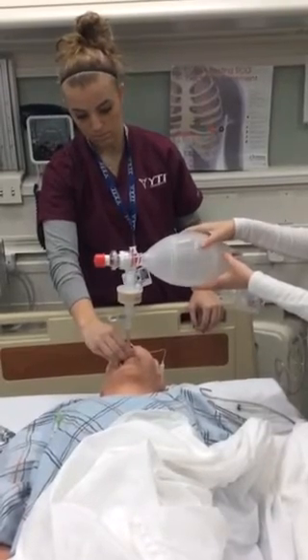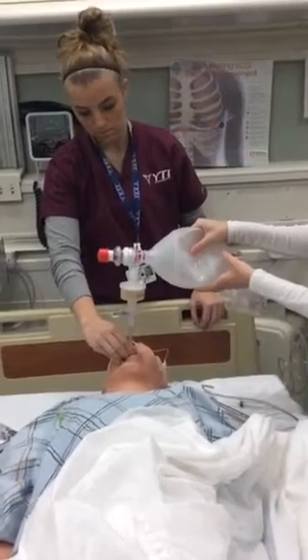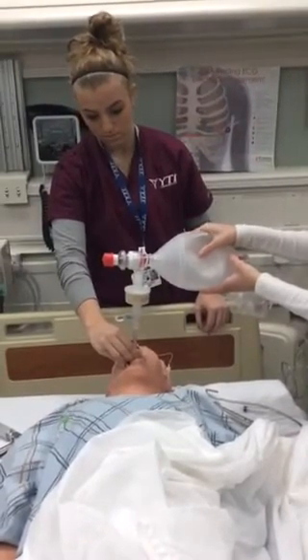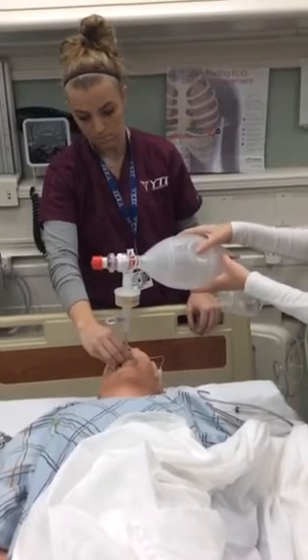Tape the tube in place and obtain a stat chest x-ray to ensure proper tube placement. The end of the tube should rest 2 to 5 centimeters above the carina. The carina is seen on radiographs at the 4th rib or the 4th thoracic vertebrae.